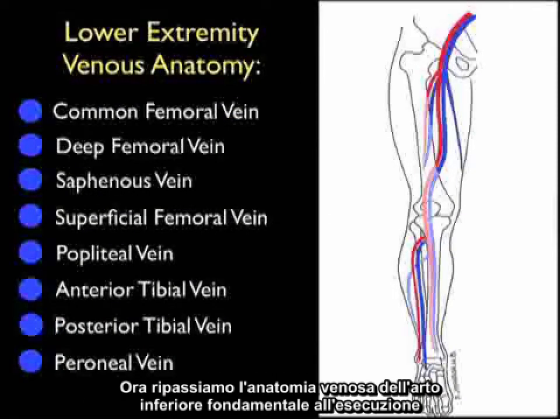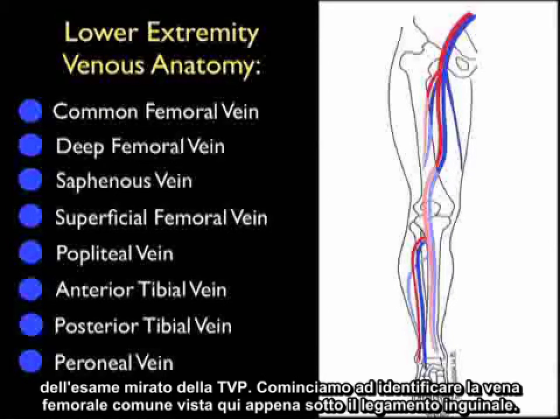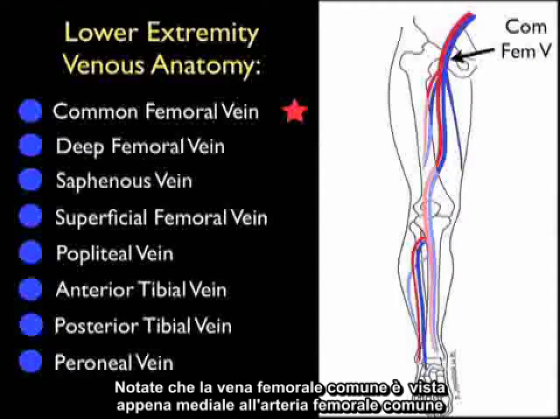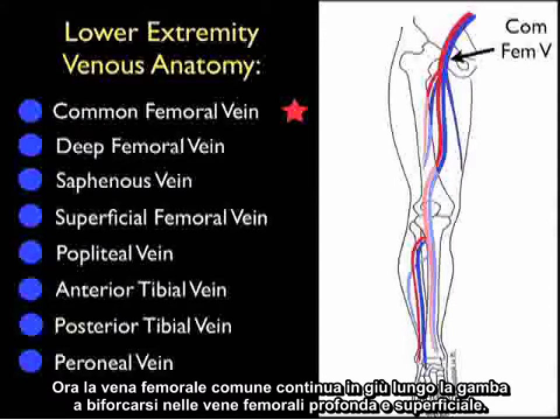Let's now review the lower extremity venous anatomy integral to performance of the focused DVT examination. We begin by identifying the common femoral vein seen here just below the inguinal ligament. Notice that the common femoral vein is seen just medial to the common femoral artery. The common femoral vein continues down the leg to bifurcate into the deep and superficial femoral veins.